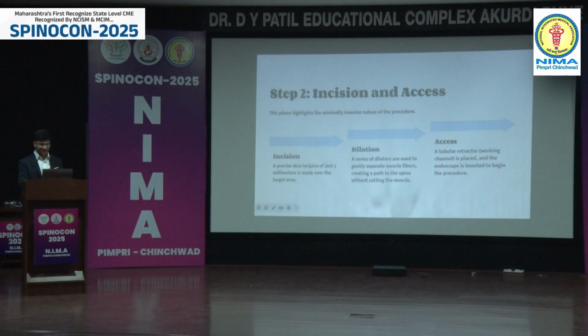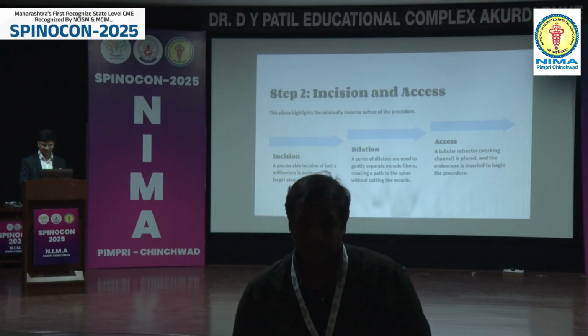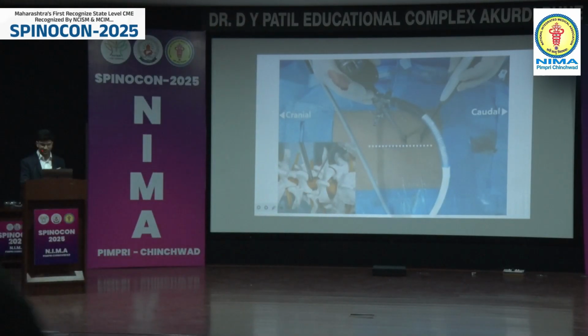Two 5 mm cuts are taken as incisions. Then the dilators are inserted. And then with the help of a tubular retractor, finally the picture is like this. There is one incision for the camera and the other incision is for the instruments.